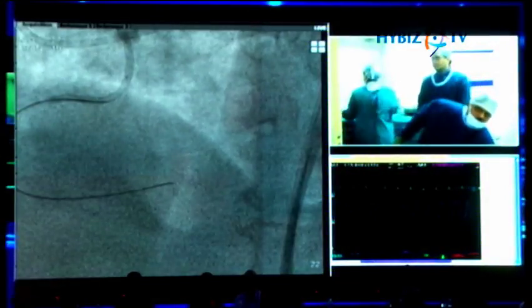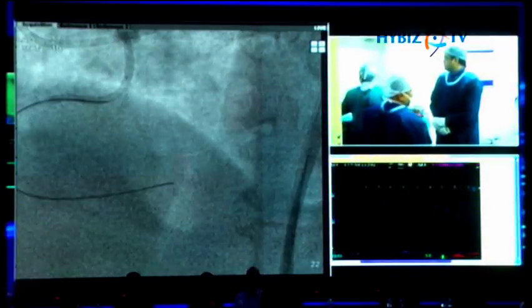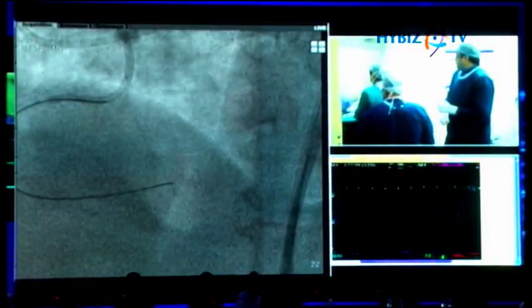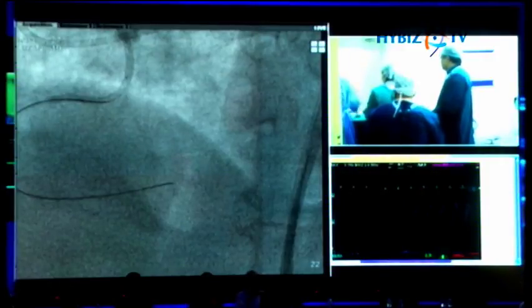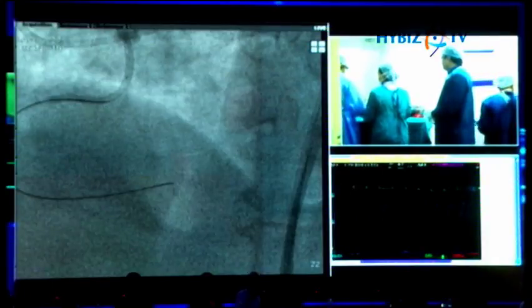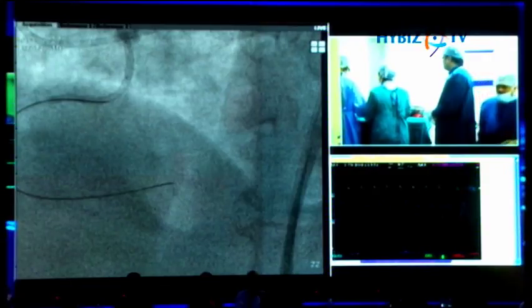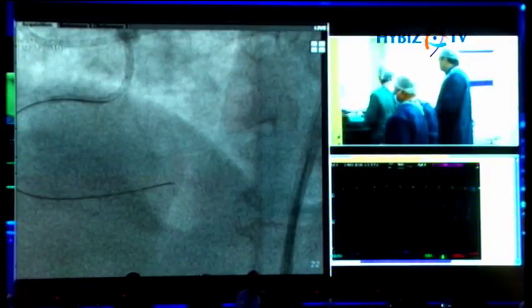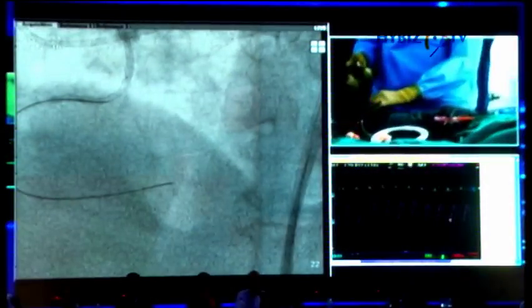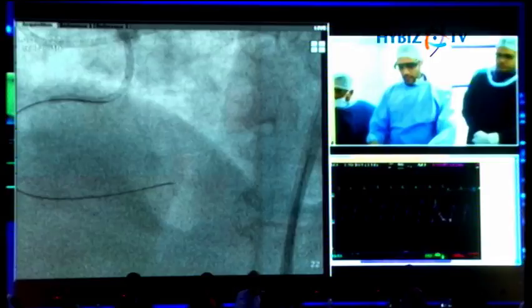Can you stop, just show us how you are going to prepare the Stingray balloon? Sure. I'm just getting the stuff that we need. Give us a 50 then. And do you have the blue stopcock? Blue color one? Is it a high pressure one? I need a 50 cc syringe. We don't have the 20. So he's going to show us how to prepare the Stingray balloon. There is a method to prepare it. Again, like I said, it's a hit or miss, but we'll try it.